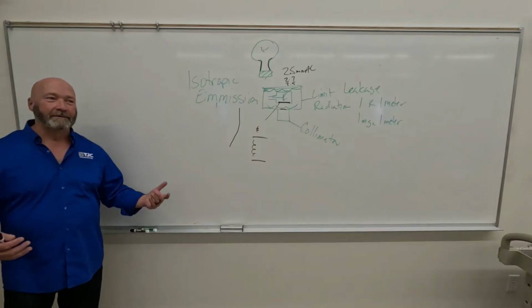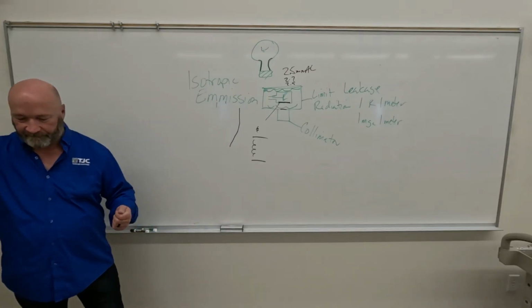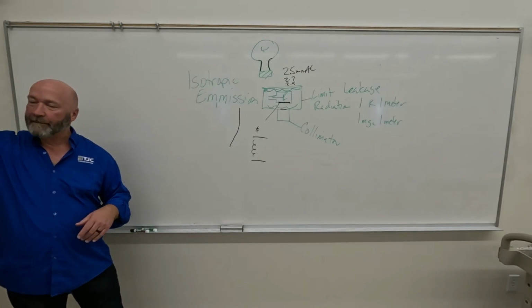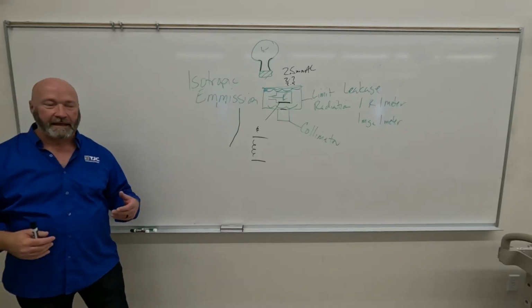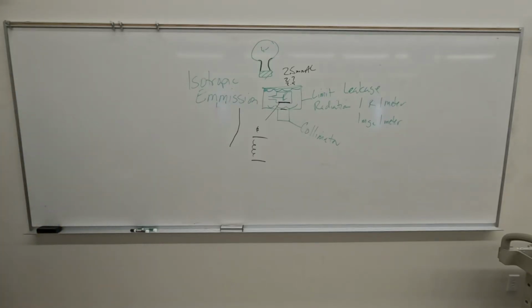So back to our falling load generator. If you were to keep it at that 1200 mA, it just couldn't keep up, right? And that's why it drops. It continues to drop just because you can't repopulate the filament with enough electrons to continue that exposure.